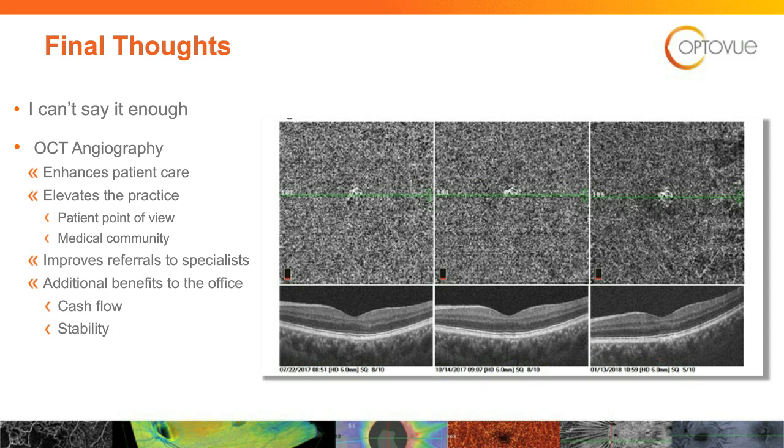So from the occult membrane and macular degeneration, OCT angiography has been great. Now, central serous, it's going to show some leaky vessels that are out there. You're going to kind of use that along with the B scan to follow those patients. But where it comes in for central serous is for knowing for sure that there is not a choroidal neovascular membrane causing that.